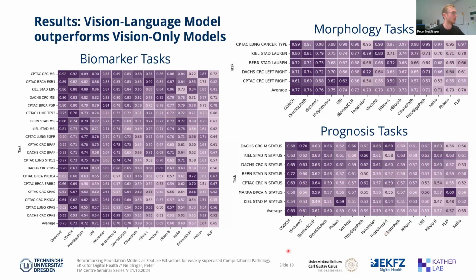The performance here is very high, with like 0.88 for the best model, but with 75 patients, it didn't work at all anymore. And I think that was because there were too few positive cases. So yeah, having more of them definitely helps, I think.